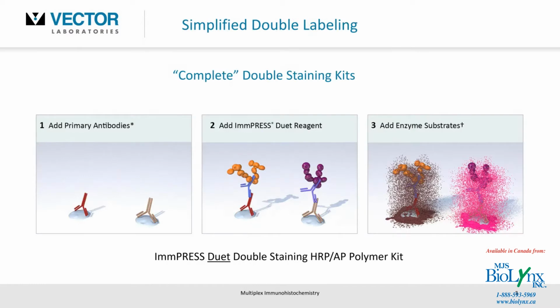Some of you may have heard about double labeling. You may have heard that it's complicated, complex, difficult, with a lot of optimization required. Well, what I've got here is what I'm referring to as a simplified methodology to obtain double labeling. You do have to have a couple of criteria in place to use one of these complete double staining kits.